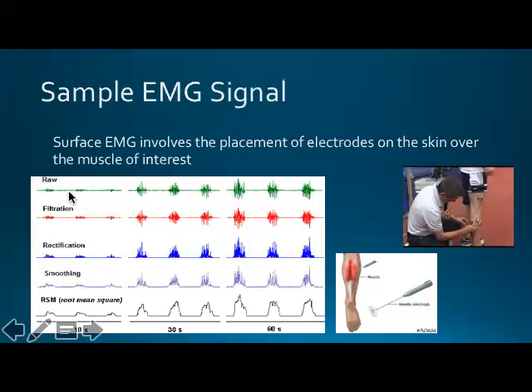So in this portion here, you have sensors, and this is an example. These are surface wireless sensors. This is an intramuscular sensor, so it's usually more precise, but you're going to get a smaller estimate of action potentials. It's more invasive. And there are fewer activities you can do with the intramuscular sensor. So usually these are limited to things like MVCs, maximal voluntary contractions, sitting, or isometric contractions of the upper body.